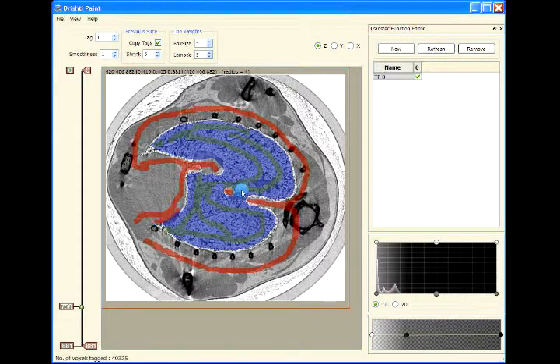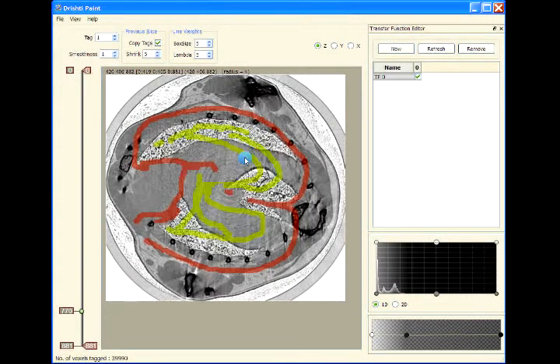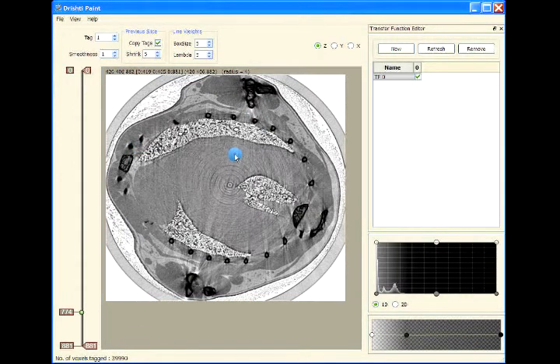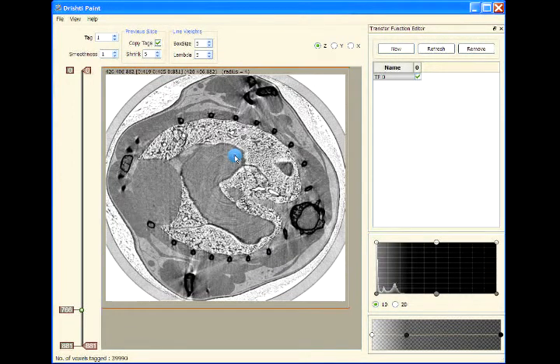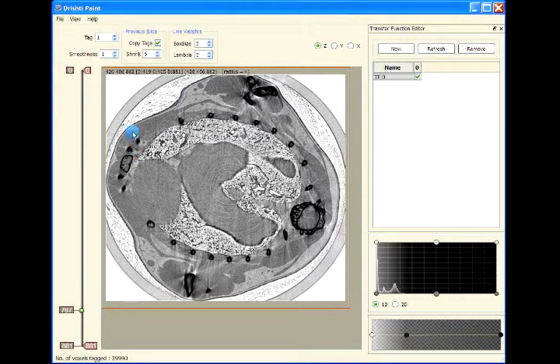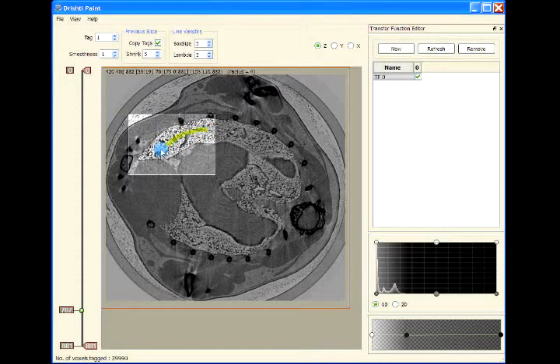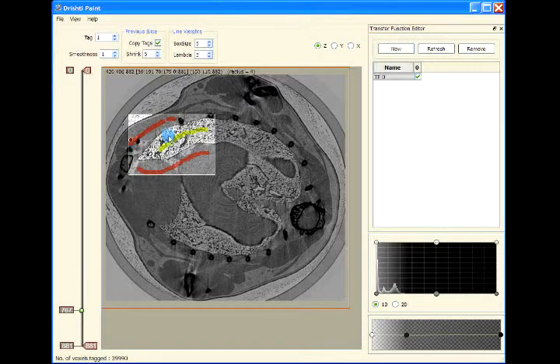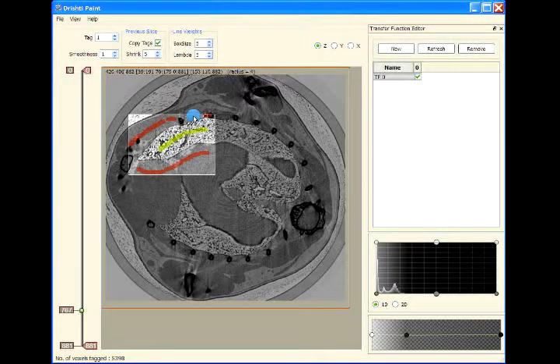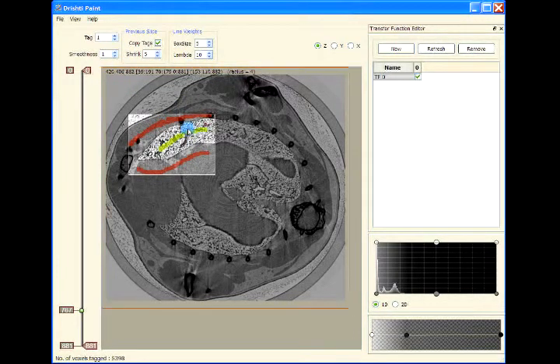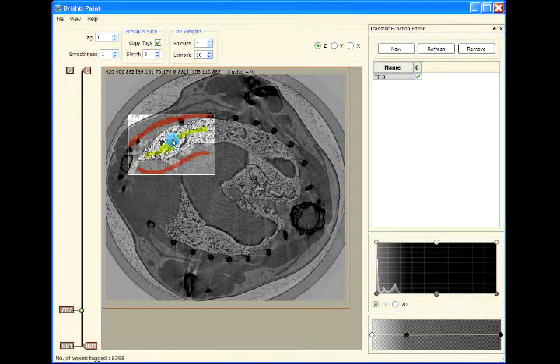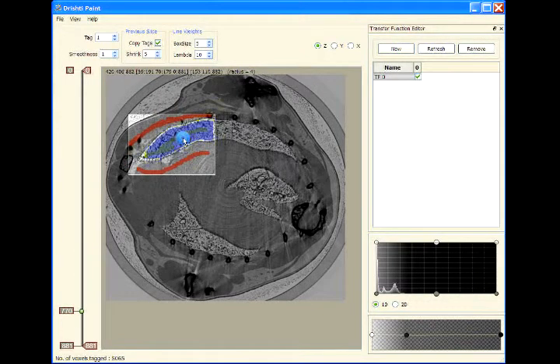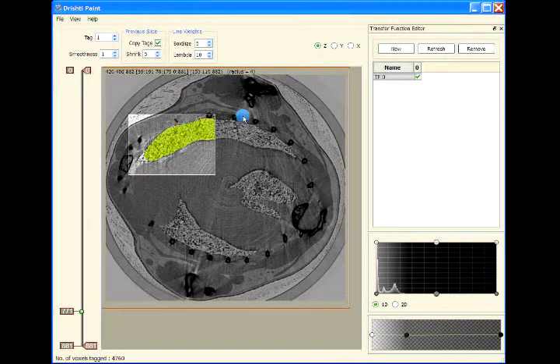Apply the background back here and then as we go forward we can do that in sections. For example, what I have done is use this section. We can go on to the next section then apply foreground and background or object and background. So we have done this section, then once we have done this section we can go on to the next section.